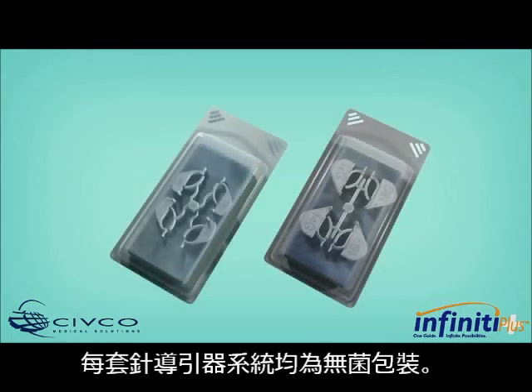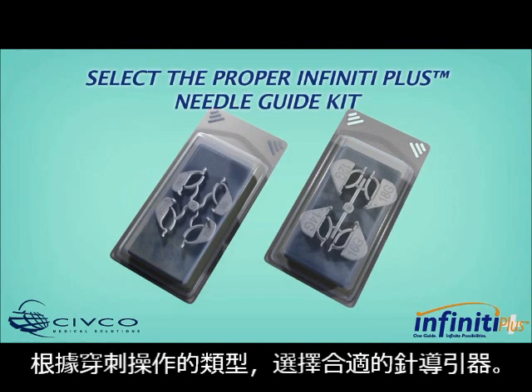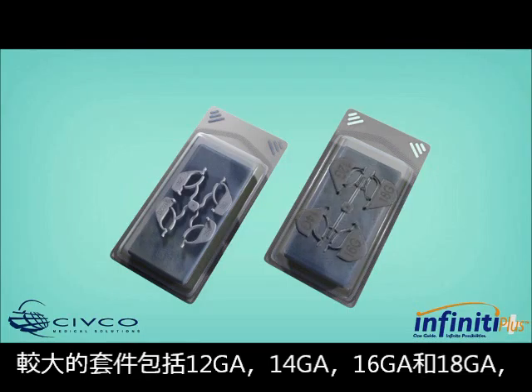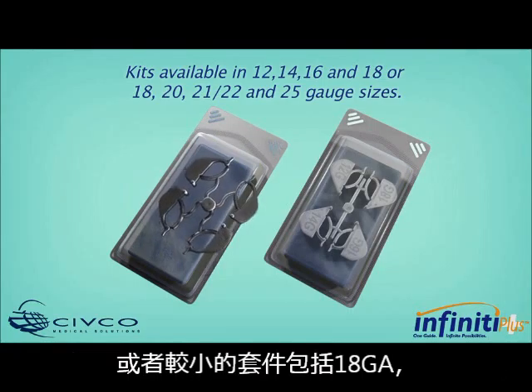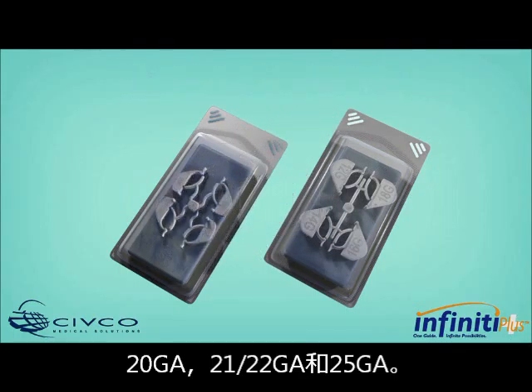Each needle guide is conveniently packaged in a sterile procedure kit. Based on the type of puncture procedure, select the appropriate gauge size procedure kit. Larger gauge kits include 12, 14, 16, and 18. Smaller gauge size kits include 18, 20, 21, 22, and 25 gauge kits are available.